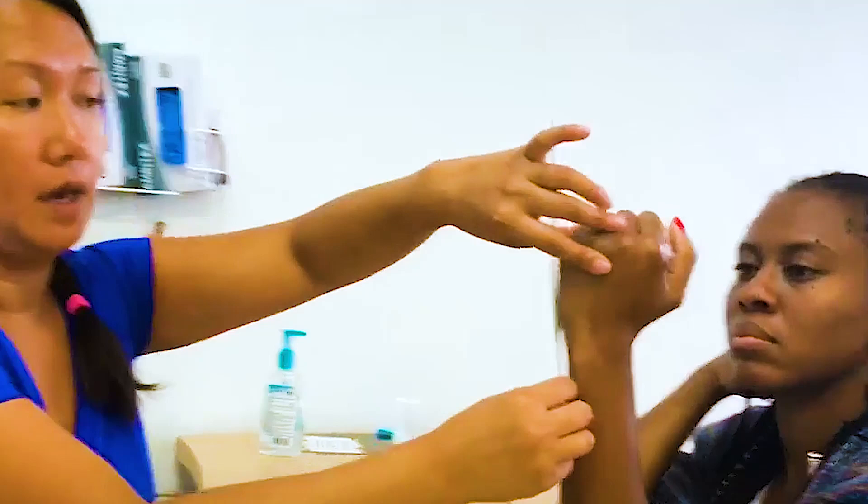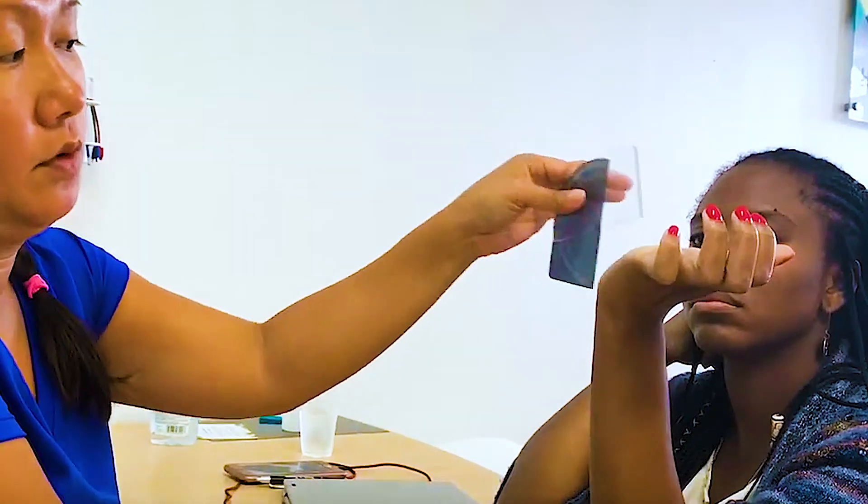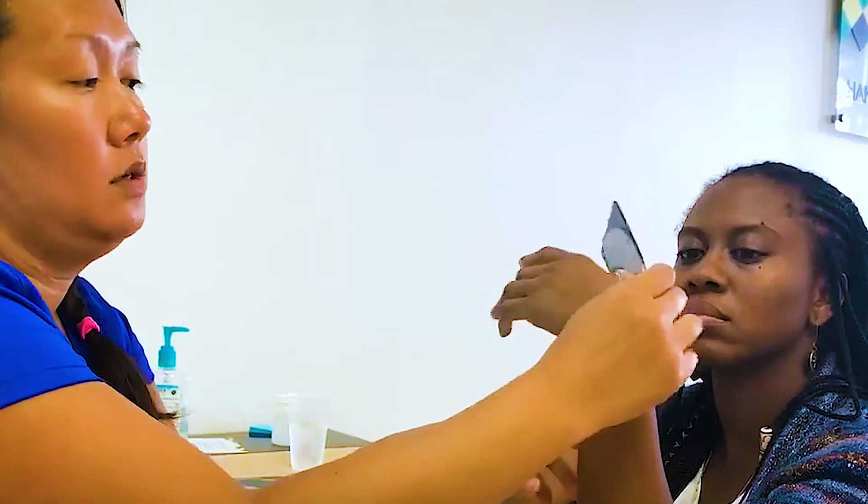I'm going to use the half moon as well for wrist. I don't usually measure on the side — I use my half moon. It's the easiest thing to use and just make sure that we're consistent each and every single time. I always measure with the hand up. You're going to go into extension, and then move that half moon and put it right over the forearm and the palmar surface. Then for flexion, you put it on the other side. If someone cannot extend and has a natural curvature of like 30 or 40 degrees with no wrist extension, you can measure on this side using the curved part of the half moon — you'd be at like 10 degrees or zero degrees, but you would have to note 'zero degrees dorsal' or '10 degrees dorsal.'